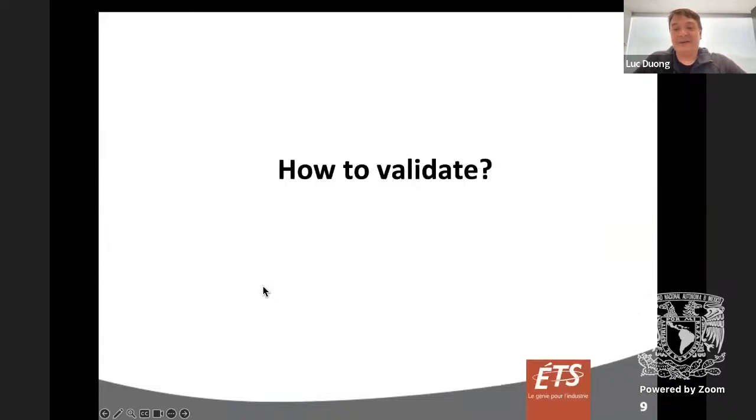This is very nice, but how can we validate it? That was our problem. We did all this work. We worked very hard to reconstruct in 3D. We were able to generate some images in 3D with the time. But our problem was that it was very difficult to validate. We could have a magnetic tracker, and get the magnetic tracker to follow and to induce a respiratory motion, and use it in the cath lab, and see if we can replicate that with the magnetic tracker. However, it's very complicated and requires a lot of effort.